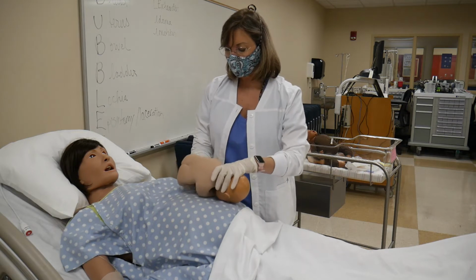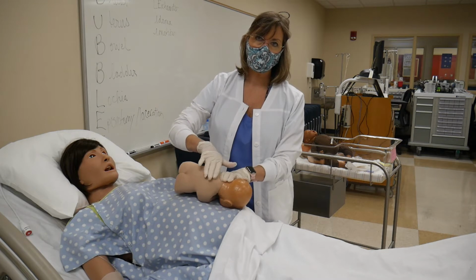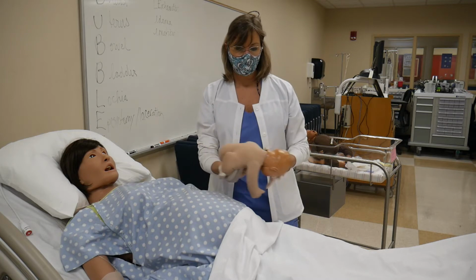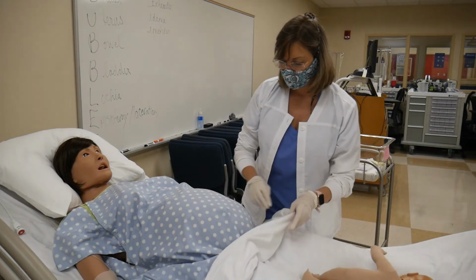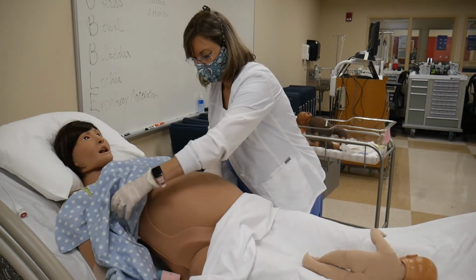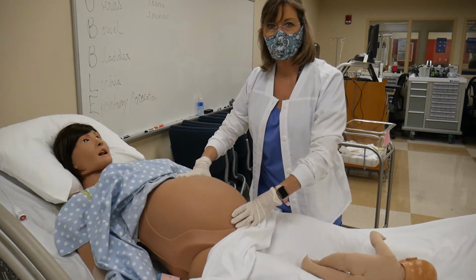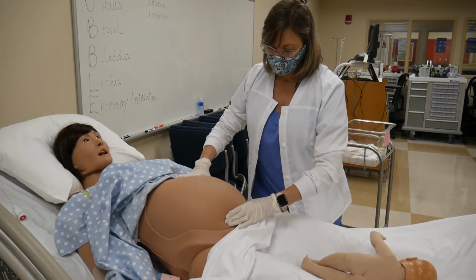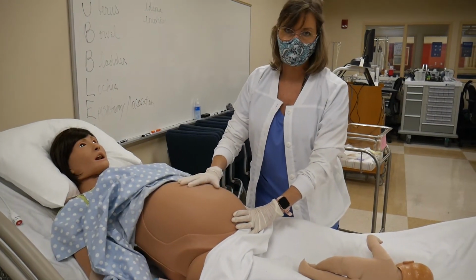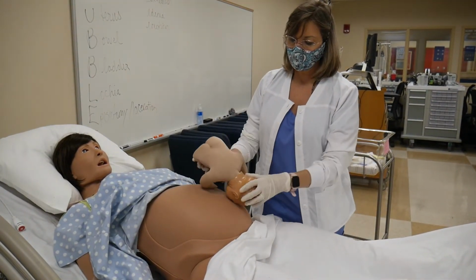So the best place when we're monitoring a baby, the best place to hear fetal heart tones is over the baby's back or shoulder. So we want to figure out what position the baby's in, and we do that with Leopold maneuvers. And so what you're going to do is feel down here, because we're going to go on the assumption that the baby's in a normal position. So you feel down here and see if you can feel the head. Now on this fetus, the head isn't mobile, but on a real baby it is.